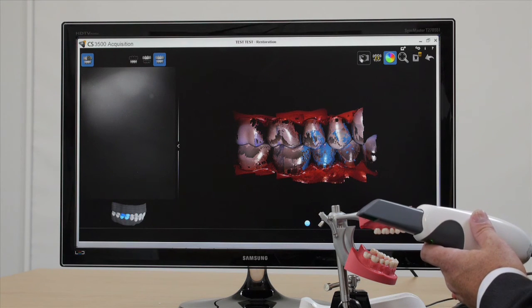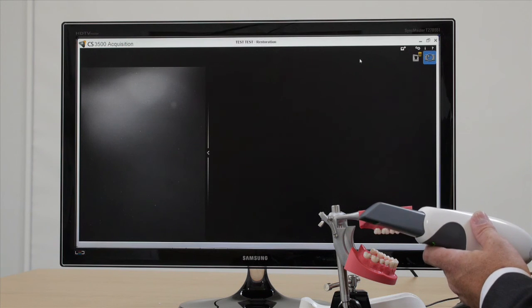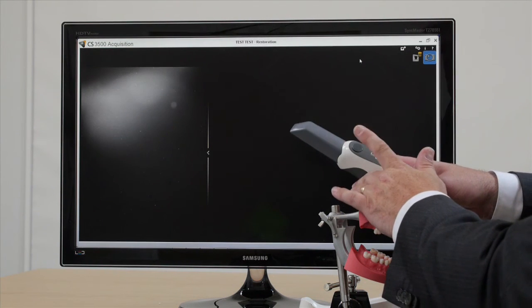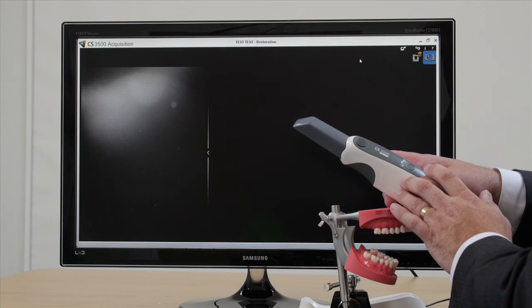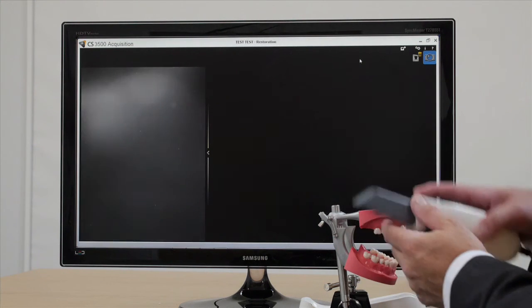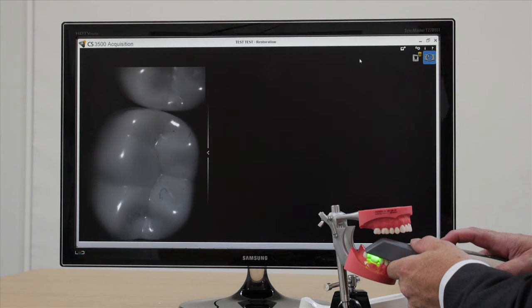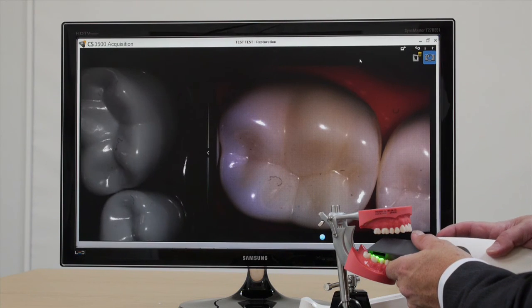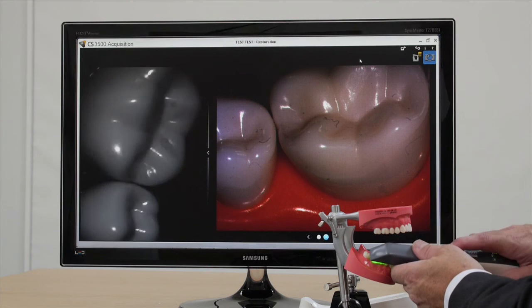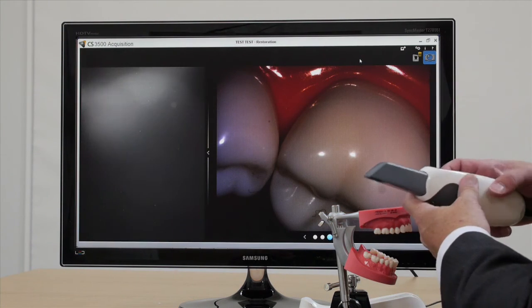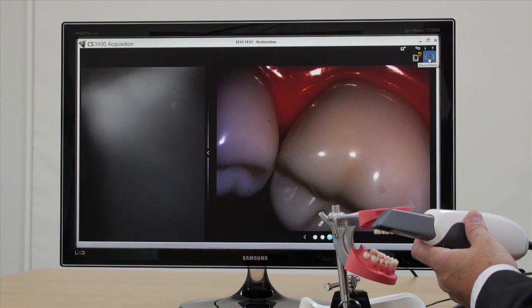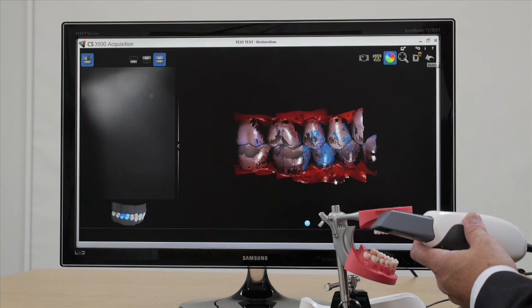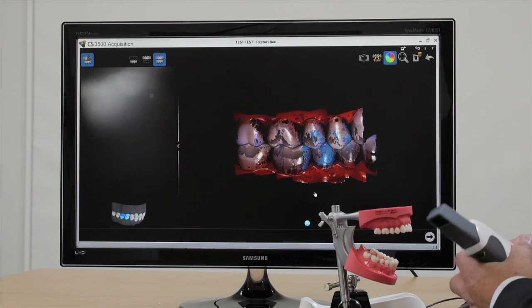Now I want to point out one other thing before we stop this section of the tutorial, which is the 2D camera feature. So press that little camera icon. You now have a manually focused and a manually operated 2D impression scanner. So I'll go over this tooth now. I'll squeeze the trigger and I'll take a picture. So you've got several photos now that will go off to your laboratory with your digital impressions. So that ends this section of the tutorial.